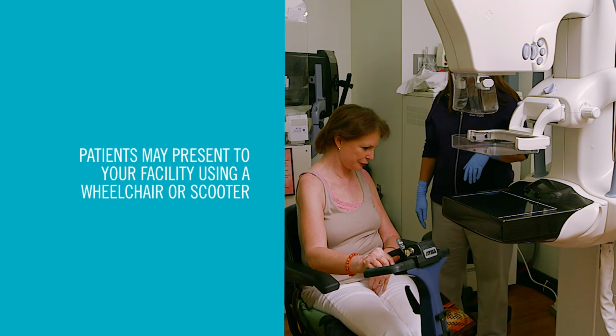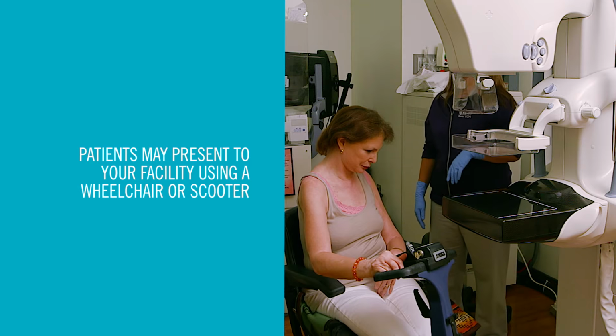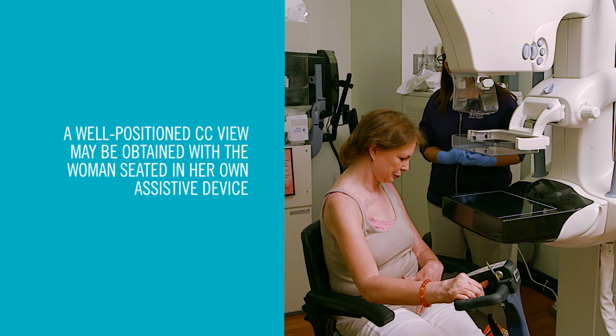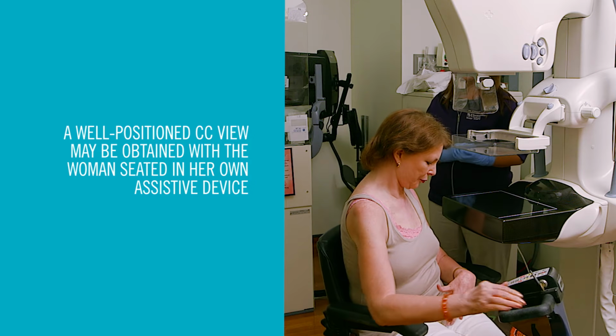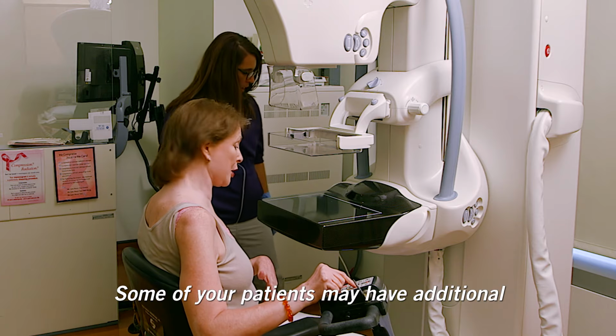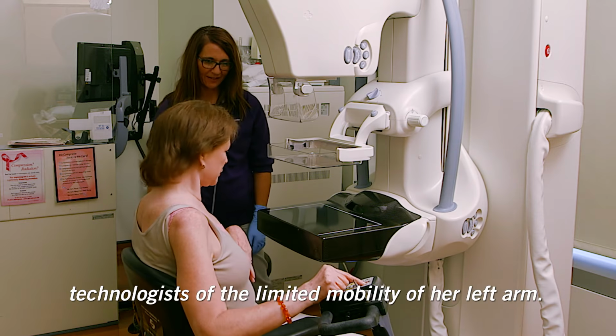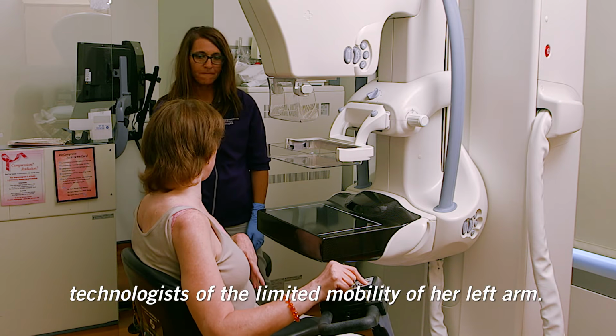Many of your patients with disabilities may present to your facility using a wheelchair or scooter. Generally, a well-positioned CC view may be obtained with a woman seated in her own assistive device. Some of your patients may have additional functional limitations. Judy, our patient here, informs her technologist of the limited mobility of her left arm.